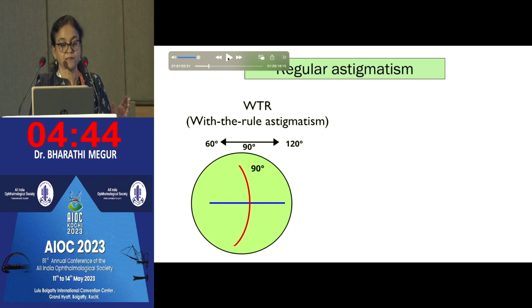So, to conclude from these 2 case studies, we can understand that against the rule astigmatism is the most common incidence, and also that we did not have high-end equipment to incorporate toric IOL in our workflow.